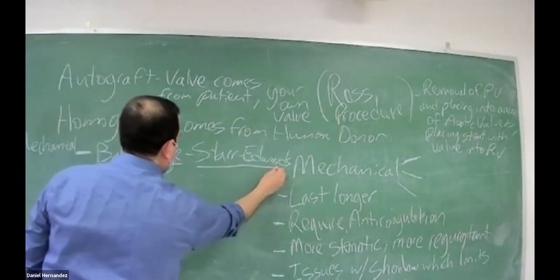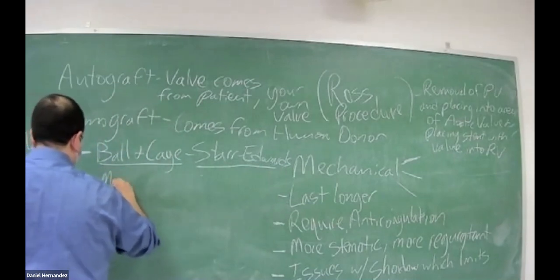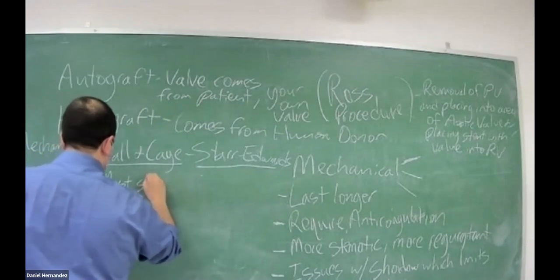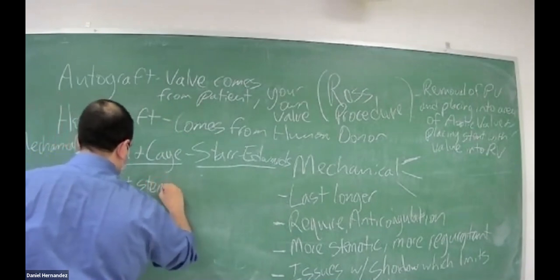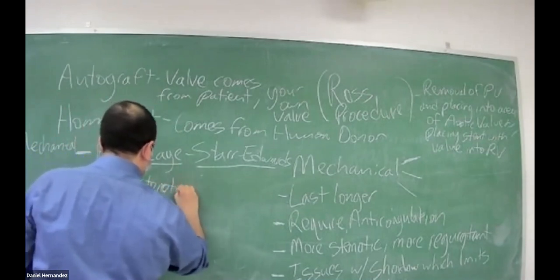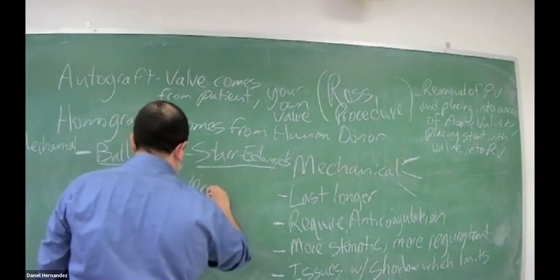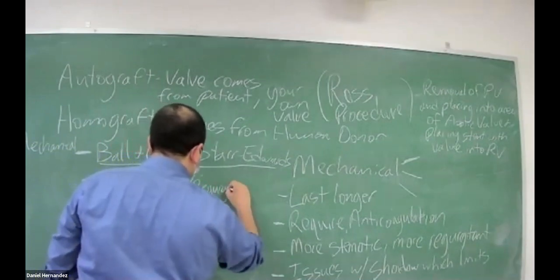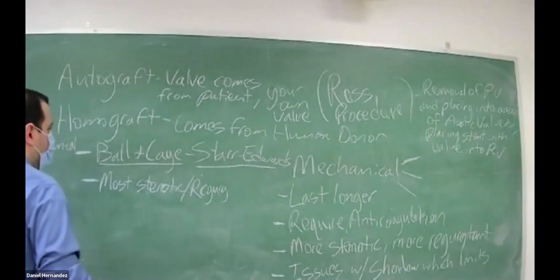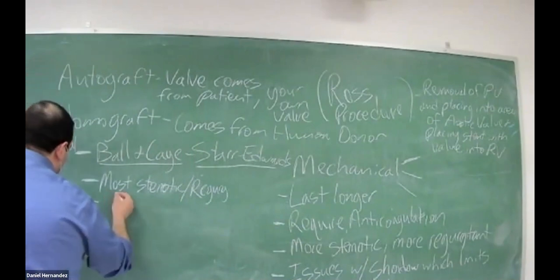Ball and cage, Starr Edwards. This is going to be your most stenotic slash regurgitant.